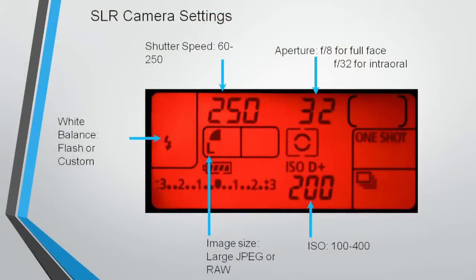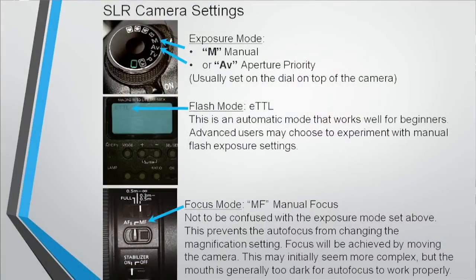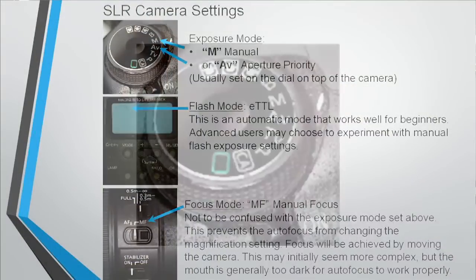But that is the most photographed slide I have in my lectures. Many people take notes of this one, many people take photos of this slide because it's an easy start. You go from here and you can take wonderful photos. So I always set it on manual. On manual. I know you said it differently.